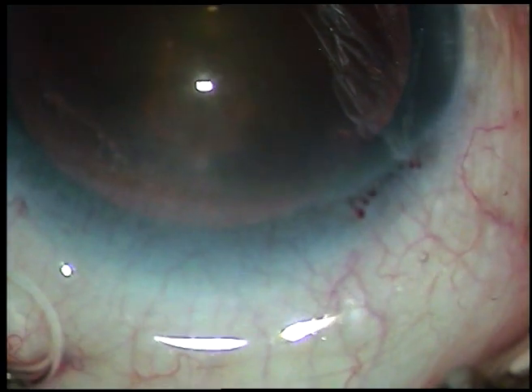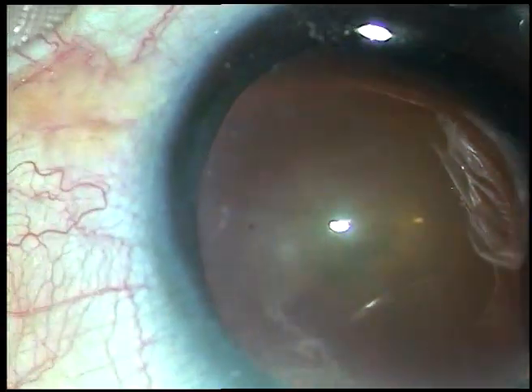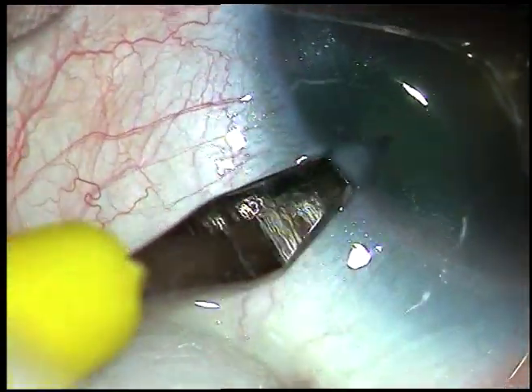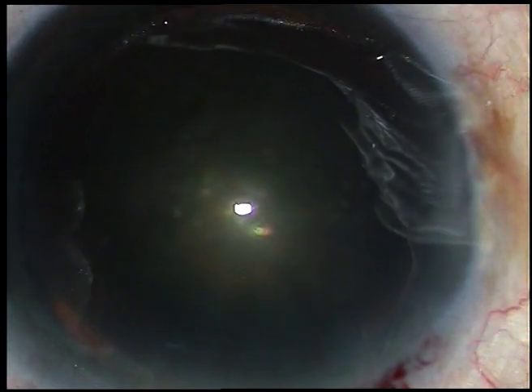In this case, only one side port is being made, on the left side of the main incision. The patient is under topical anesthesia. The side port incision is about 3 o'clock hours away from the main incision.